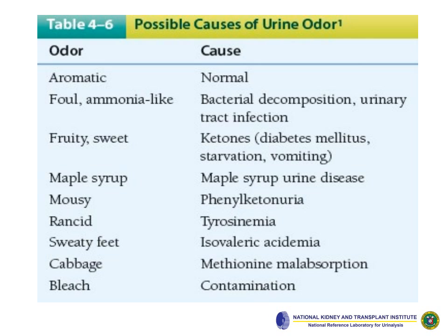This table shows a variety of odors encountered and their causes.